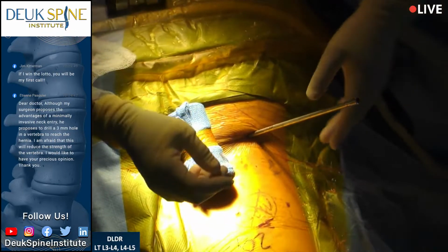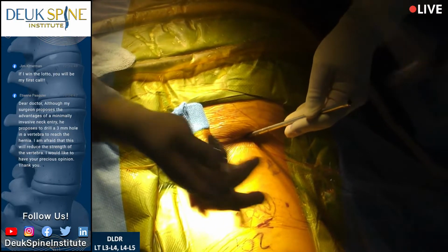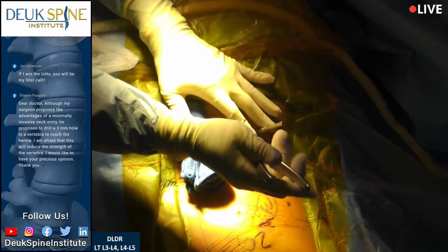All right, we're going to move forward. Our anesthesiologist has given us the green light. Shot? Yep, let's take that out.